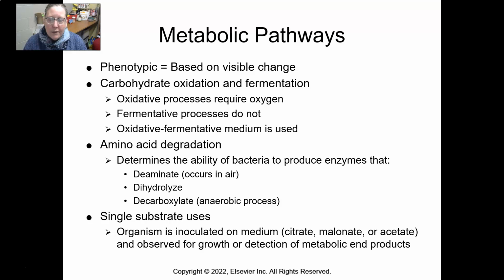And so, again, the metabolic pathway assessment is a phenotypic way to identify bacteria, and it's based on visible changes, color changes, if they metabolize a certain thing. So if they oxidize some carbohydrate or ferment some carbohydrate, of course the oxidative process does require oxygen, the fermentative process does not. And so we use oxidative fermentative medium. A lot of that's built into these little metabolic panels that we can use.